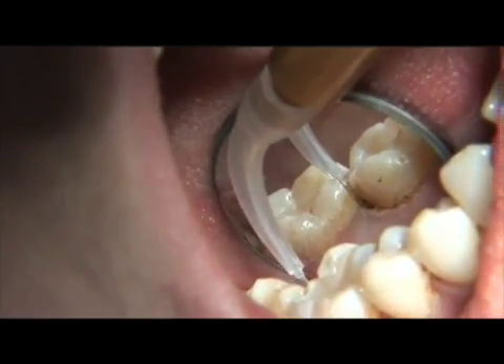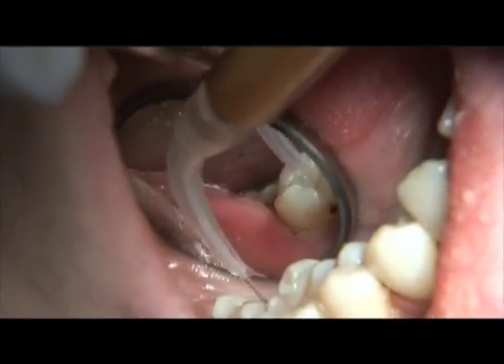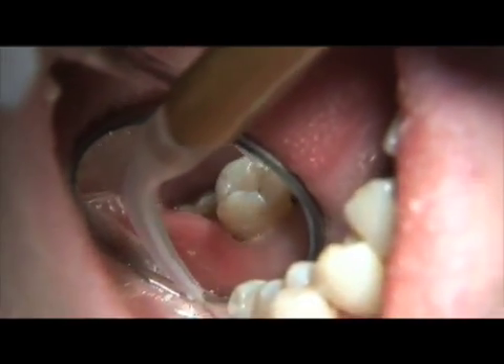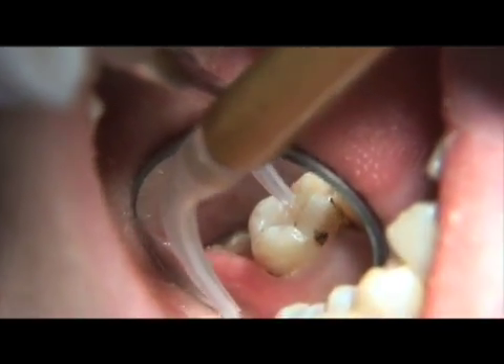Because the laser fiber is so small, treatment access is made easy, even in the most challenging areas of the mouth. Be sure to provide proper oral hygiene and post-operative instructions. Pain medication is rarely indicated for laser periodontal therapy.